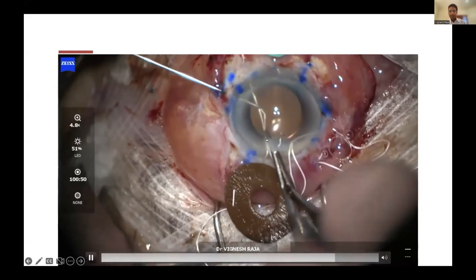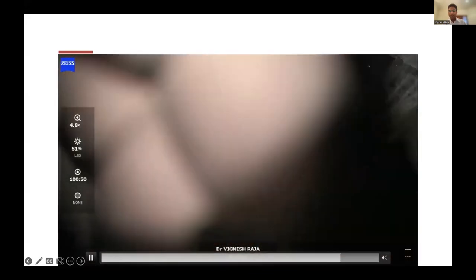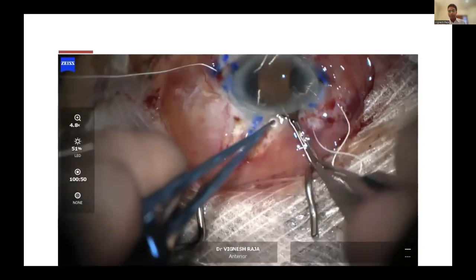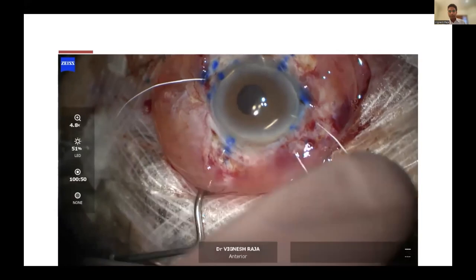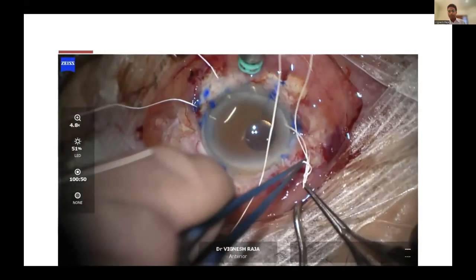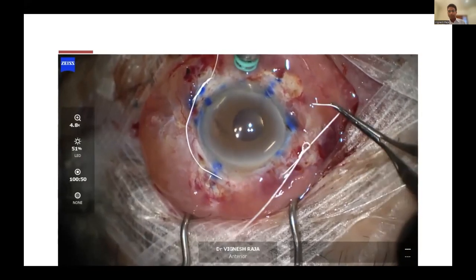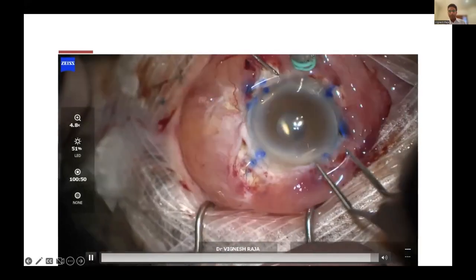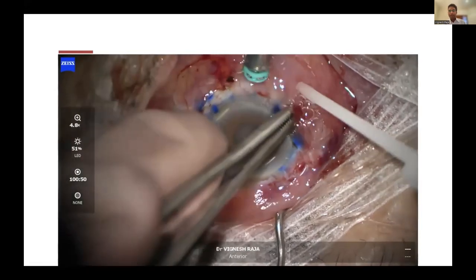And you can actually see the toric lens along that axis very nicely. This one, we can just fold it, and we have to extend the wound to about 4 to 4.5 millimeters. The only thing with this technique is you see these two white lines, but after what the patient's gone through, that should be fine. And I'm just closing the conjunctiva with glue.